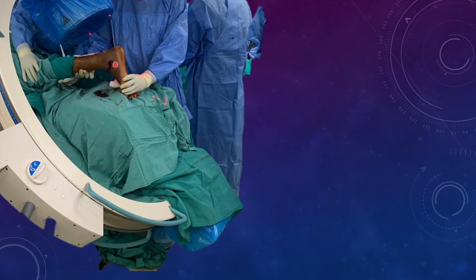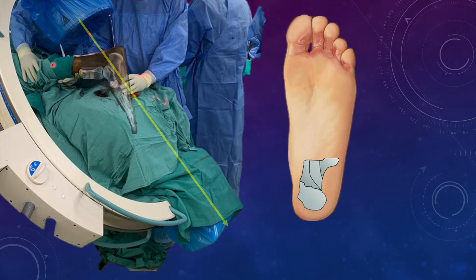The second problem is that for getting a good view, we need ankle dorsiflexion, and it is very difficult to get the ankle dorsiflexed in this uneasy position. Even the assistant holding the limb in internal rotation finds it very difficult to keep the limb static in that particular position. So definitely it is going to be stressful and you'll be struggling to get a good axial view.